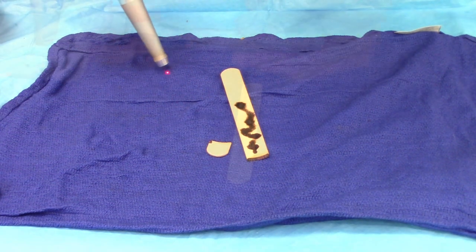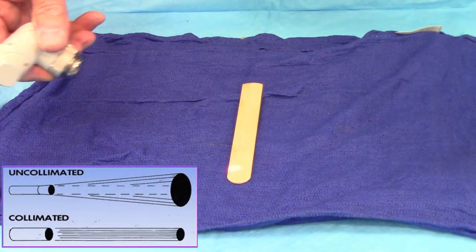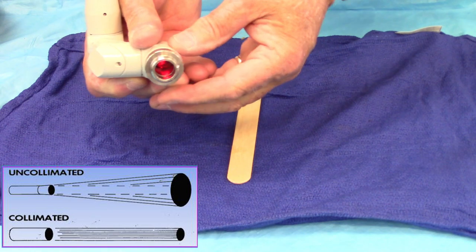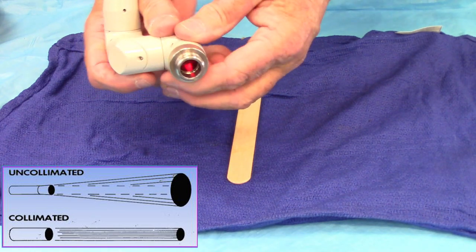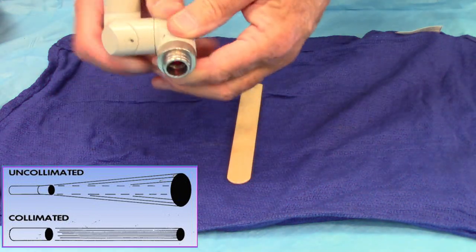Now let's look at the collimated beam. Here I've taken the handpiece off of the knuckles of this laser, so I have just the articulated arm with the knuckles coming out. Let's see if I can shine that up there — that's the guide light shooting right now.